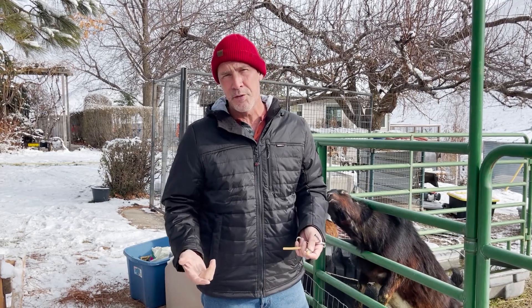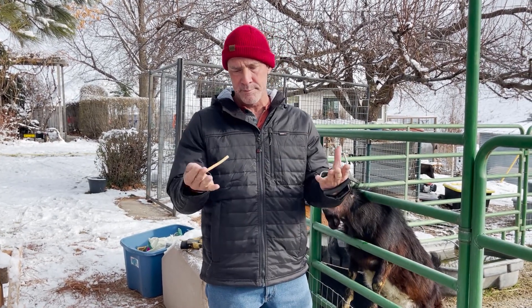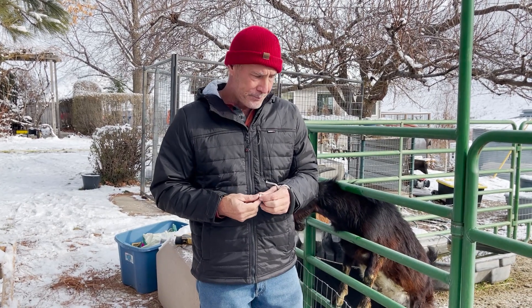Everybody seems to have their one preferred method. I've done all three and they all have positives and negatives. But considering the whole picture — the ability to do it yourself without a vet, no open wound, how much pain the goat goes through, how quickly it's done, and the frequency of problems — this is my choice. I like the California Bander and it works really well for me.